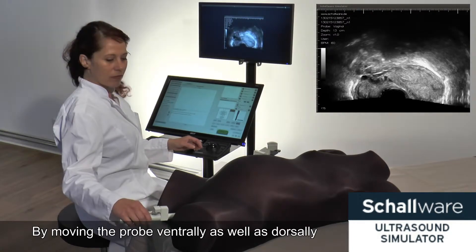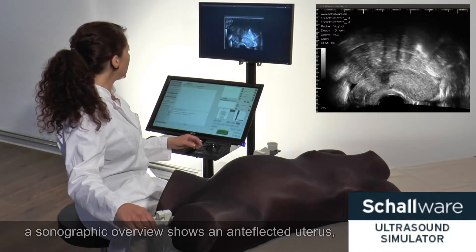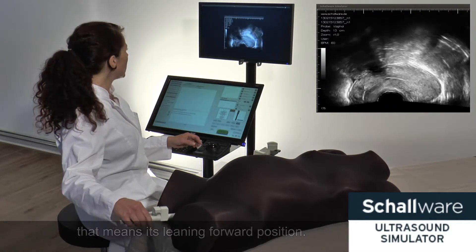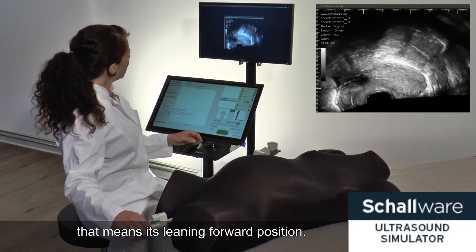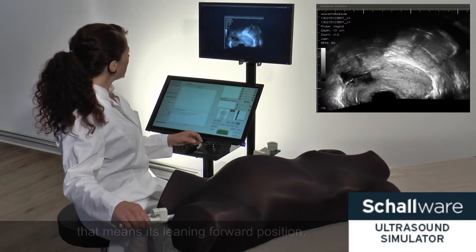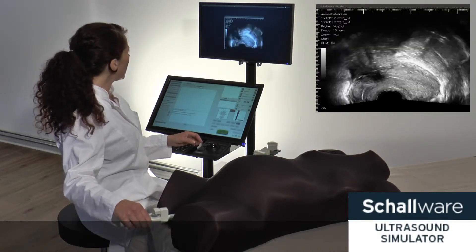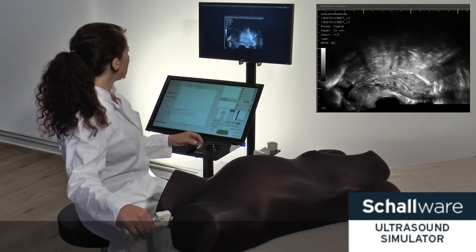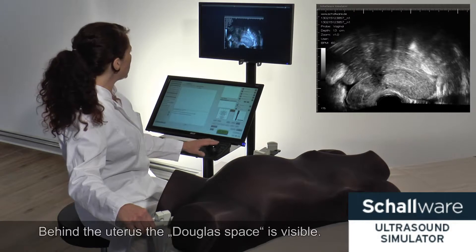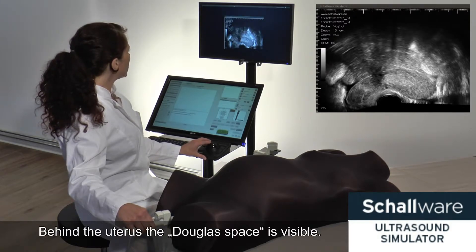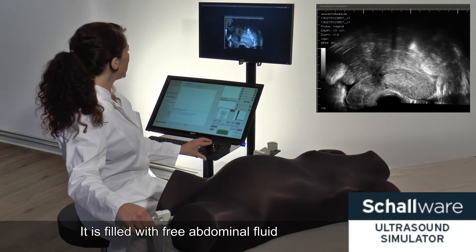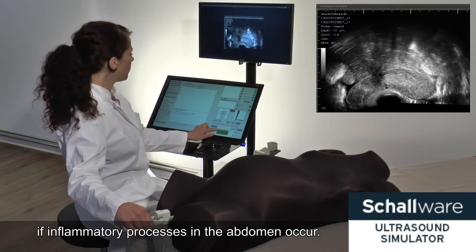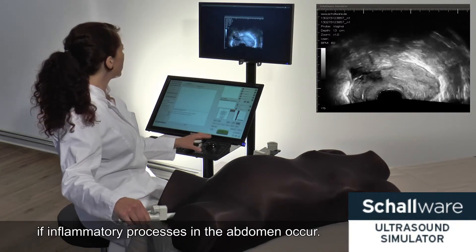By moving the probe ventrally as well as dorsally, a sonographic overview shows an anteflexed uterus — that means its leaning forward position. Behind the uterus the Douglas space is visible. It is filled with free abdominal fluid if inflammatory processes in the abdomen occur.